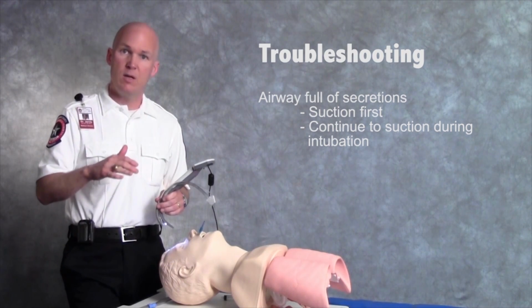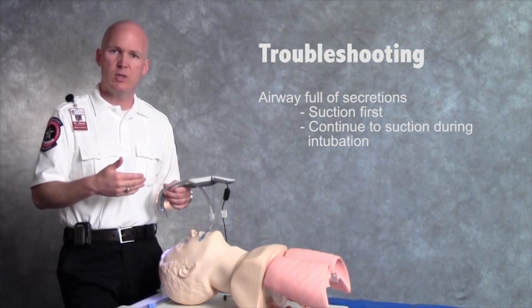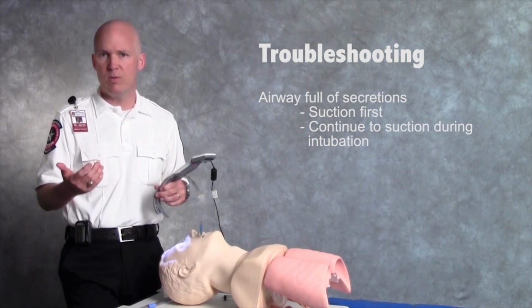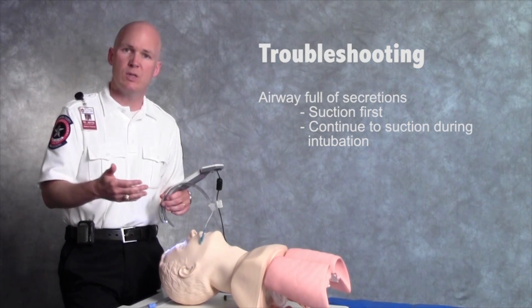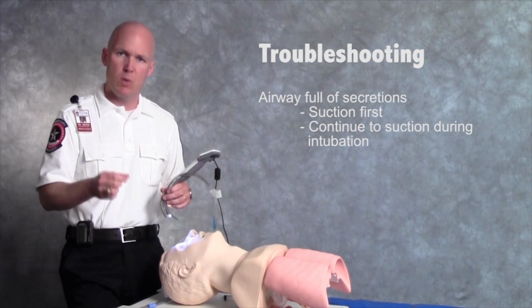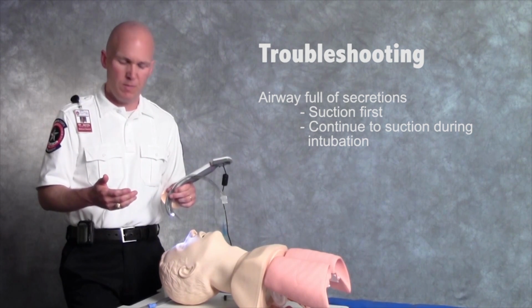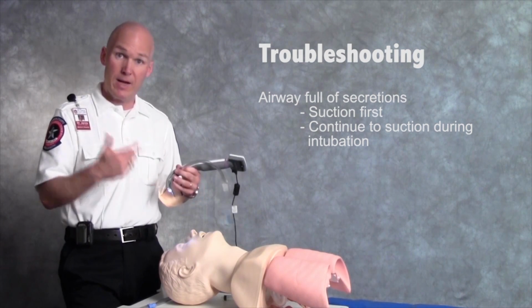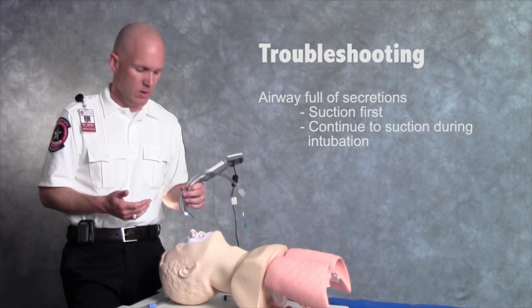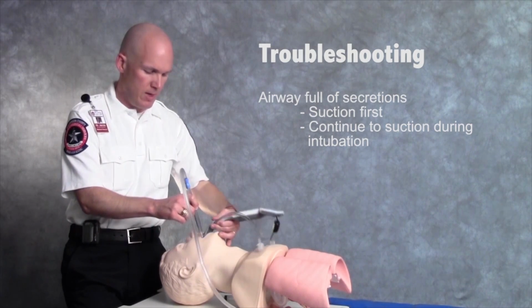Once we cleared out the other issues of holding the blade and going in midline and not going too deep and getting the view, the big issue that we have now, we think we've resolved now, is that there are an awful lot of secretions in the airway. I think with almost any video device, if you submerge the lens of the camera into the secretions, you're going to get an obstructed view. So you can either do that, back out, wash off the tip of the camera with a saline flush, which doesn't take very long, or you can avoid the situation to begin with by suctioning early and then intubating.